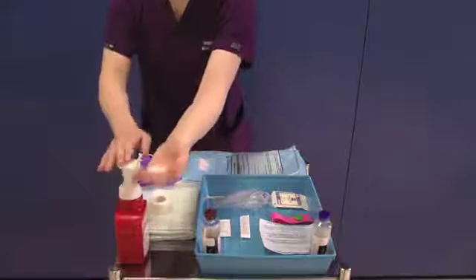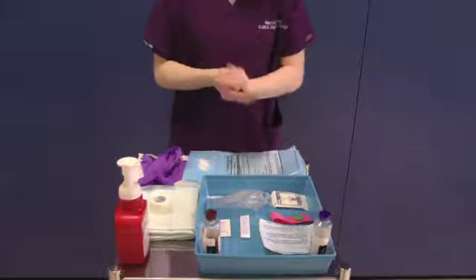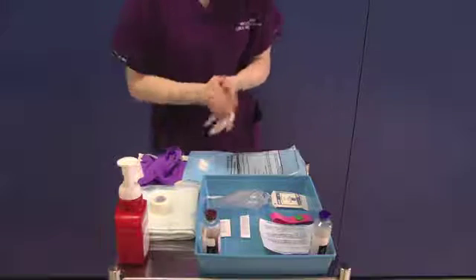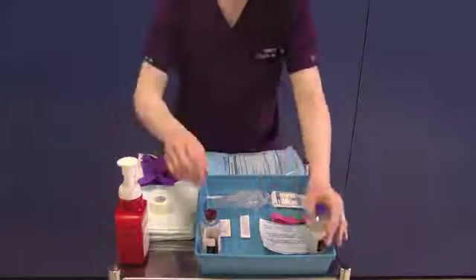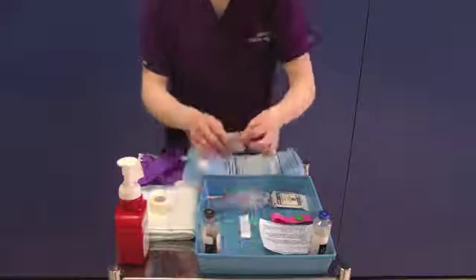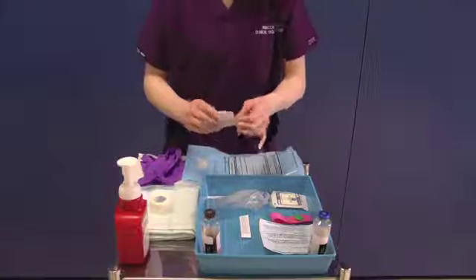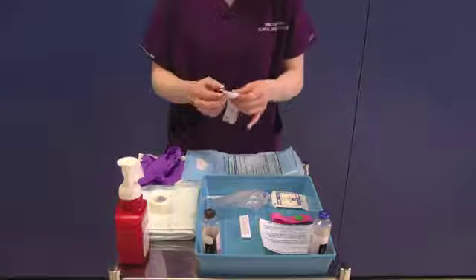Decontaminate your hands and remove the plastic caps from the culture bottles. Clean the newly exposed bottle tops with the chlorhexidine wipe for a minimum of 15 seconds each and allow to air dry.